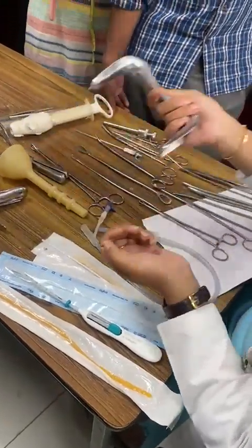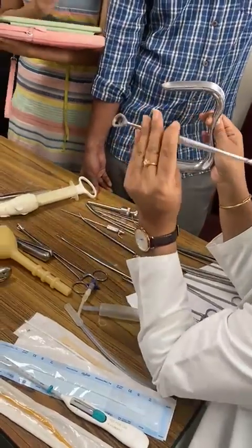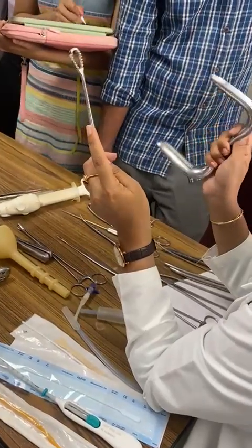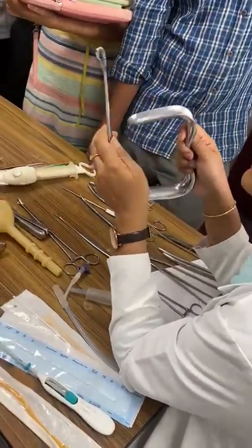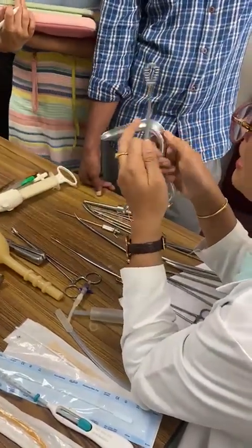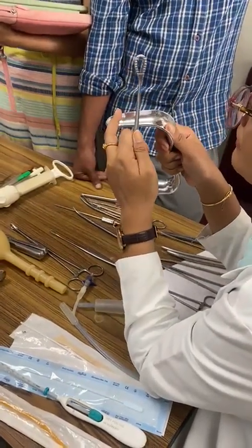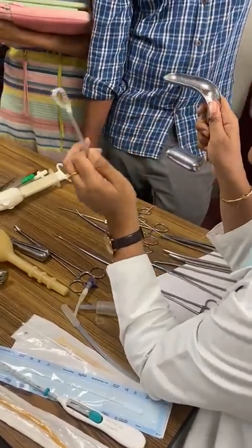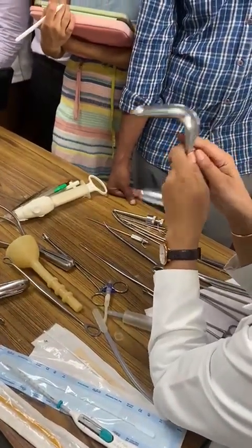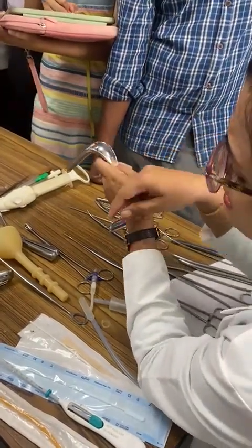Coming to another OPD basic examination instrument, this is a speculum, and this is a vagina. You will have to name the instrument and say about its uses, or describe the instrument. You'll have to say it has 2 blades. You can get a one-bladed Sims speculum also. Such instruments will be kept for your exam. The 2-blade speculum is used to depress the posterior vaginal wall and visualize the cervix.